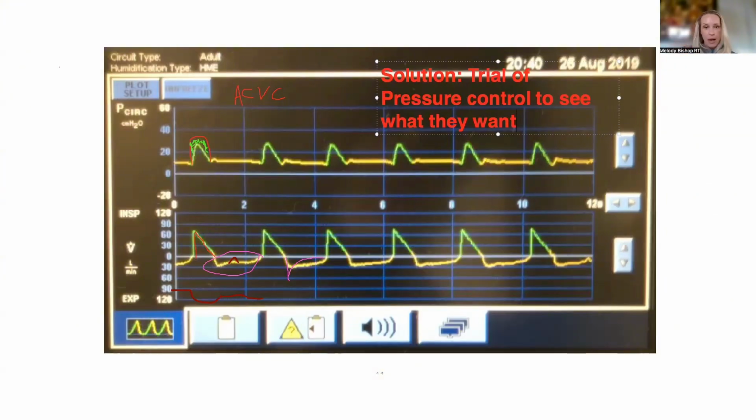And it might not work, you may have to then adjust some sedation, but you may notice that the patient starts to settle so that they're not pulling these insane volumes, because now they're at least satisfying what they wanted initially. So it's one of these where you have to watch them closely, stay at the bedside, and reassess. But just that switch and allowing them to have a bit more flow and more support might allow them to settle enough that you can stay within your goals, like you outlined so nicely. Right. No, that's a good point.